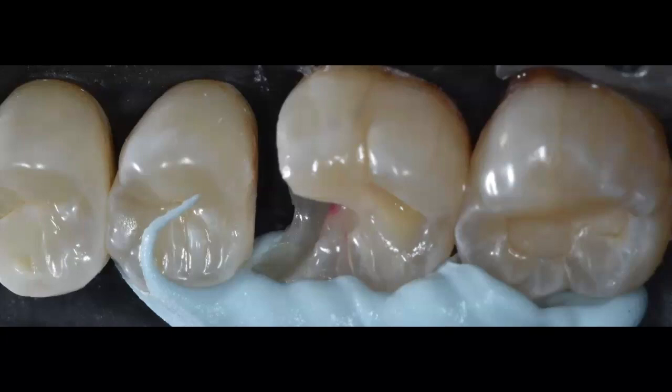So once I remove that unsupported enamel and all the decay, you can see that first I'm using the buccal matrix. I added some composite to that buccal matrix, and I'm now reestablishing the ideal anatomy of that buccal wall extension of my enamel. I'm rebuilding it with composite, but using this matrix that was a copy of what nature had given this tooth. And I'm going to do the same thing on the lingual wall.